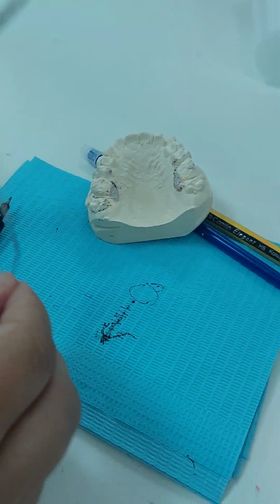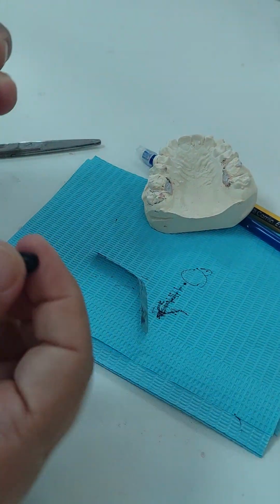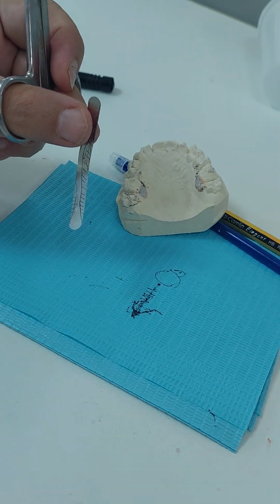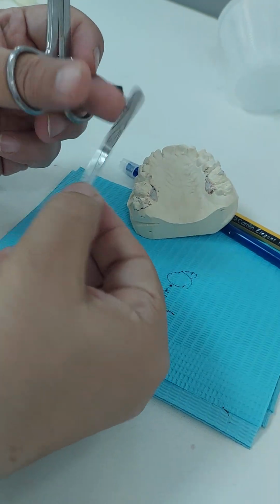So I'm going to bring the scissors. So it's a pattern. I'm going to provide you with a link for a paper that also contains this pattern and shows you how to do it. But you can cut it. By the way, there are some ready-made deep marginal elevation matrices. But these are expensive, you're going to buy them. But why not use something that you have in the clinic?